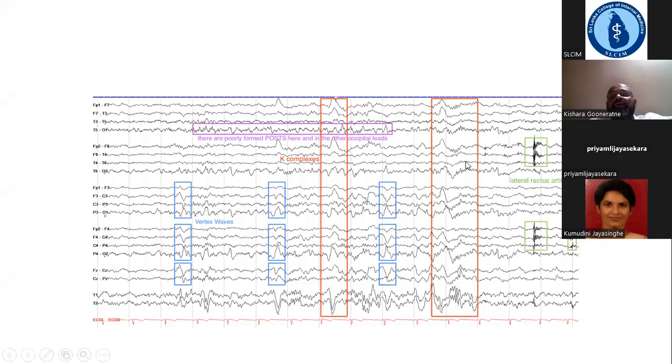And these are again sleep spindles and K complexes. If you're not careful, when we talk about epileptiform discharges, we will see how similar these may look, and therefore they need to be interpreted in context, to know whether this is actually normal or abnormal.